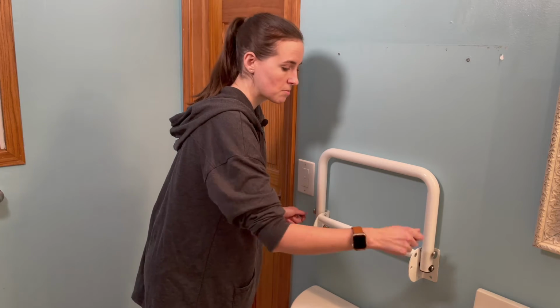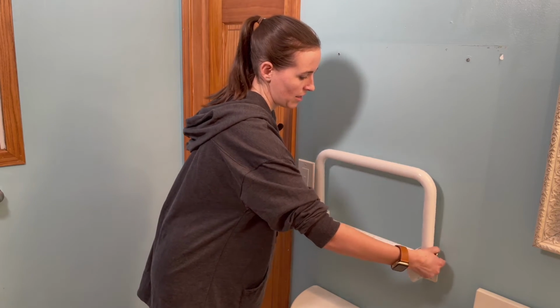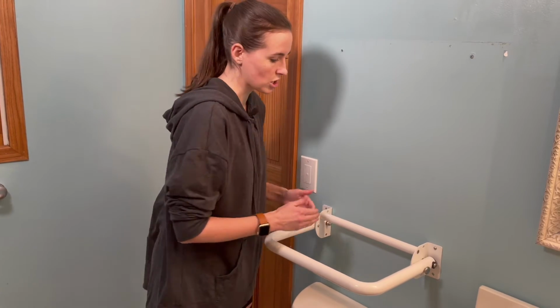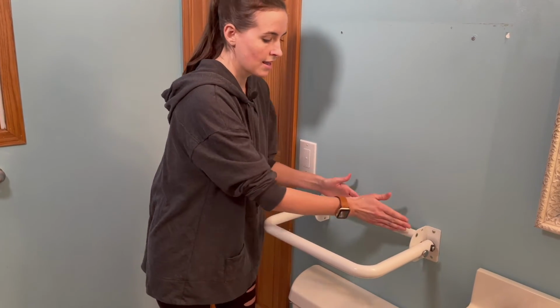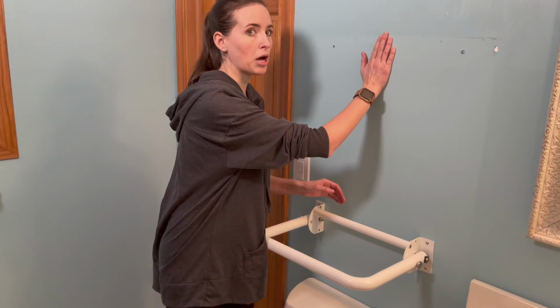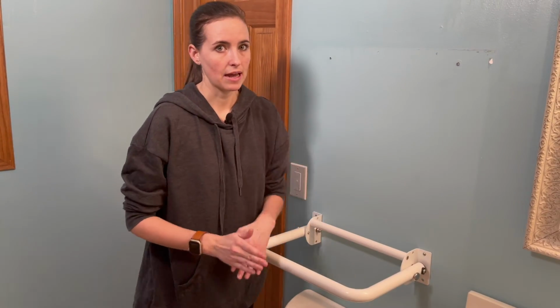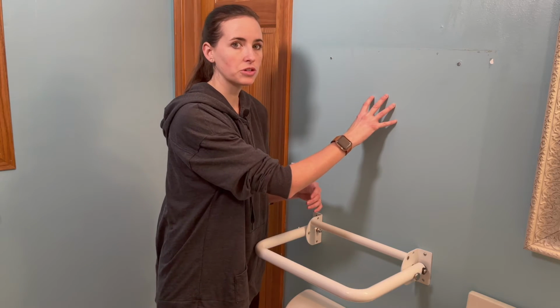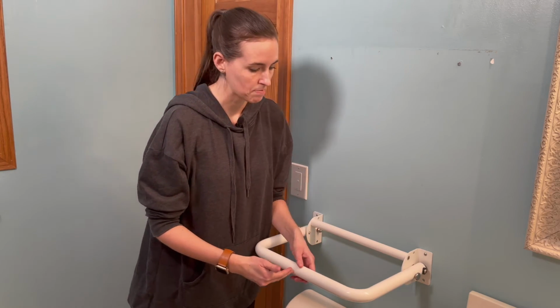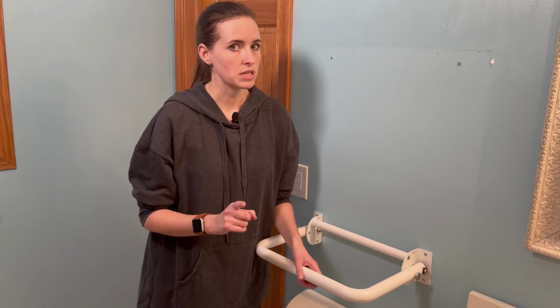It has two simple pins that allow this to be dropped and then securely locked in position. It's 16 inches wide and has a 12-inch depth when it's folded down. It can both fold up or fold down depending on where you position it. I obviously had it folded up when it was being put away so that it was easier and closer to the toilet for me. So here's how I would use this product.